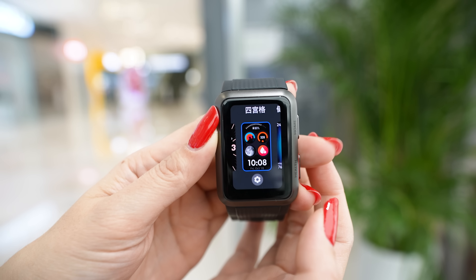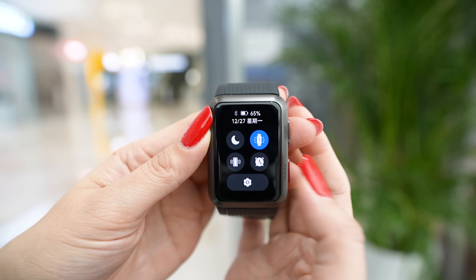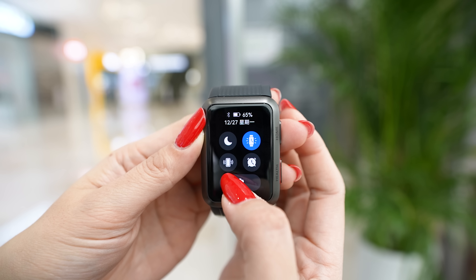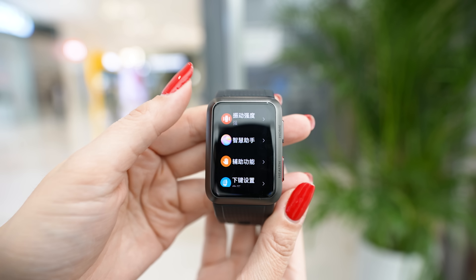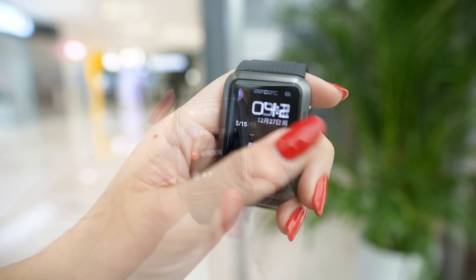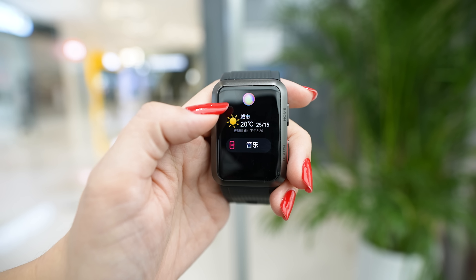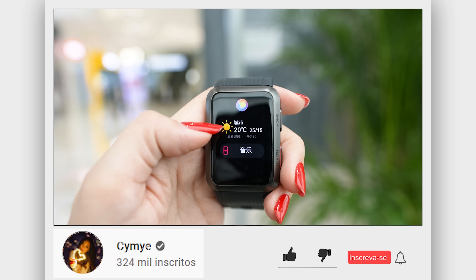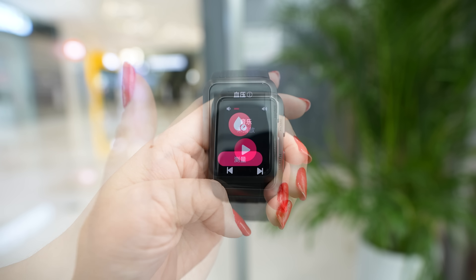From the top swipe down, you can see DND, battery, and data. We also have an option to keep the clock on for 5 minutes, find your phone, alarm, and settings. From the right swipe left, since we're not connected to the phone, it's asking for Bluetooth, but at the bottom we have the voice assistant connection, weather, and if you click there you can enter the music controller.